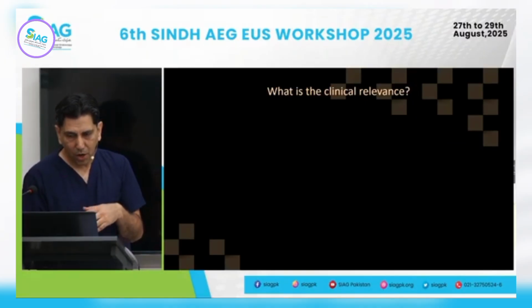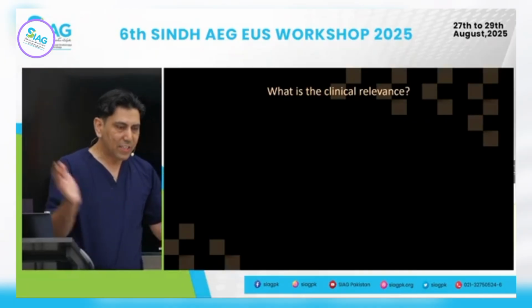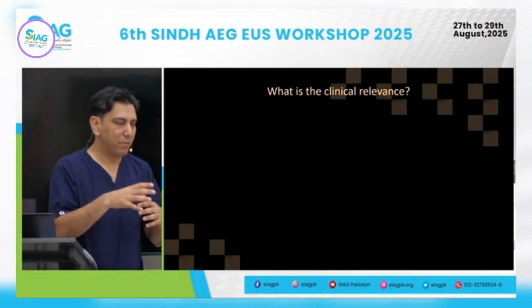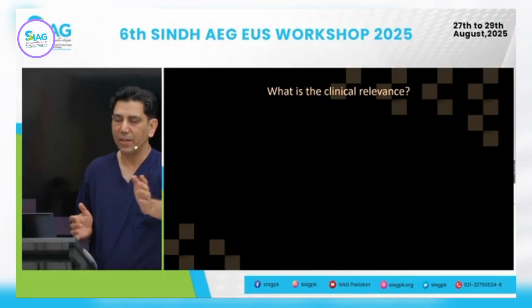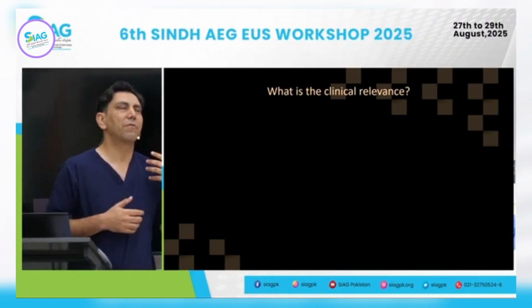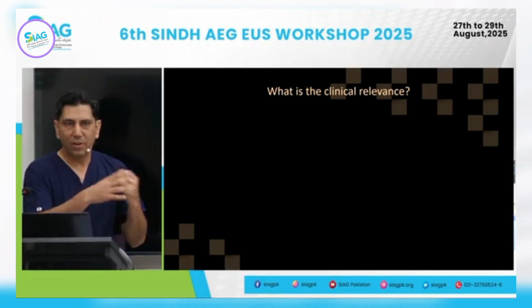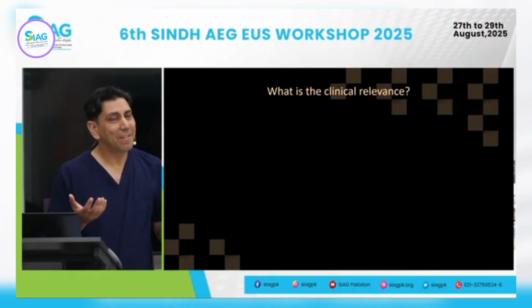And now we will talk about, so why are we actually talking about liver anatomy? Traditionally, the teaching has been through the station-based approach or your base camp, and we have an approach of looking at the left lobe of the liver and then going to the aorta and then identifying the organs there. But why are we not focusing so much on the liver? Why do we want to identify the segments of the liver, what the vascular anatomy is, what the relationships are, what is the relevance, I guess.